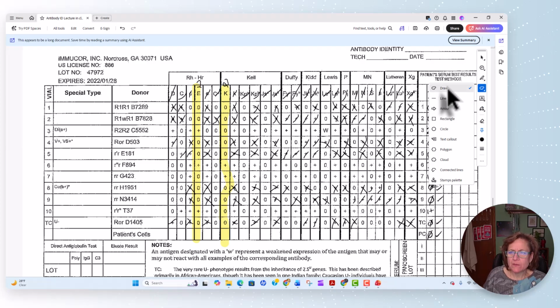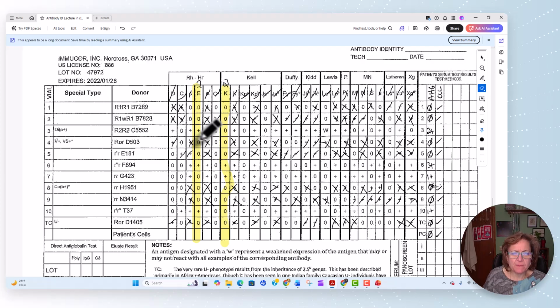So now we're going to look, and I got a positive here, which is positive, but that's negative. They're both positive here, positive. I got a positive here, negative, positive. So it looks like these two together might make it. Remember that rule, we have to have two positive just for one and two positive just for the other. So I got one here that's positive for big E and negative for K. And is there another one? Yep, I got another one here that's positive for big E, negative for K. That's positive over there. So I got two for big E.